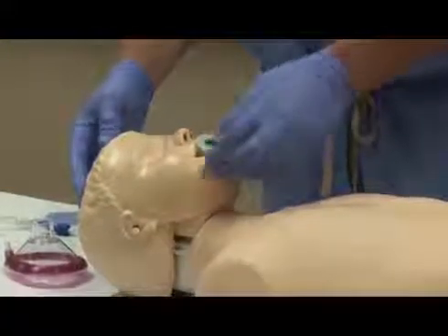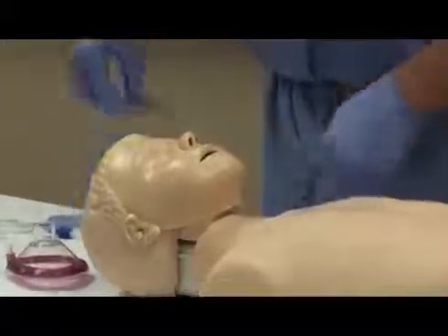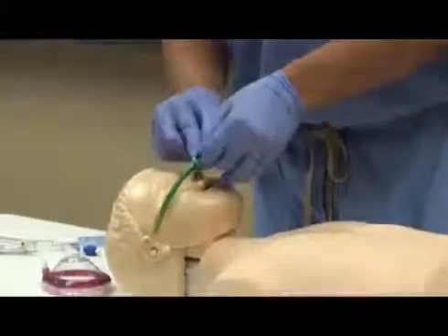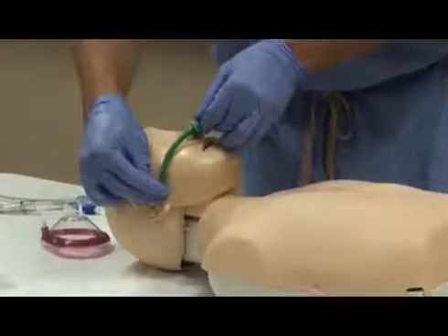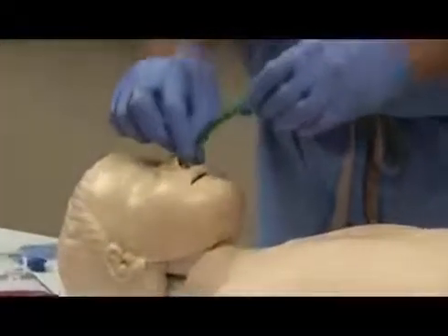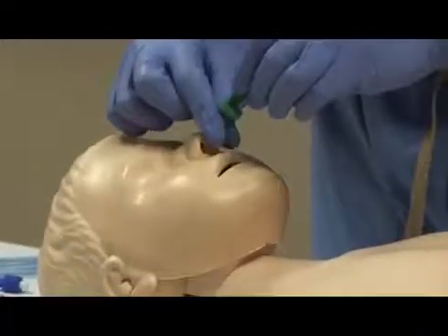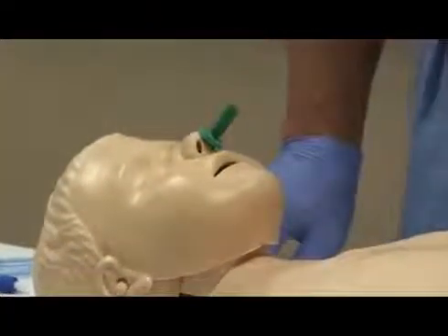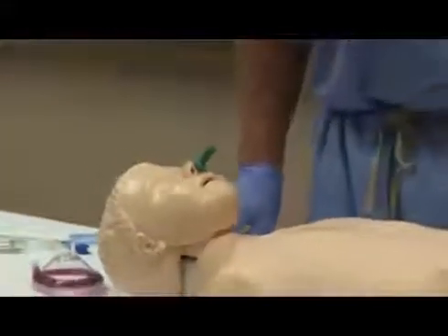Selection of the proper sized nasal pharyngeal airway is done by assessing the flange at the nostril, and the tip should reach the tragus of the ear. To insert, place the tip perpendicular with the maxillary bone using gentle pressure in a spiral motion until the device is in place beyond the nasal pharynx, providing a patent airway.